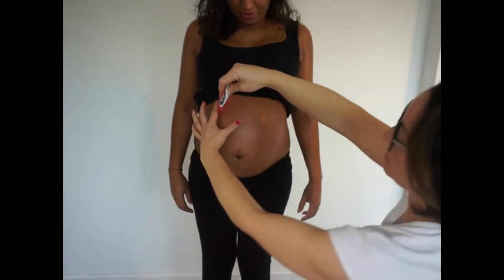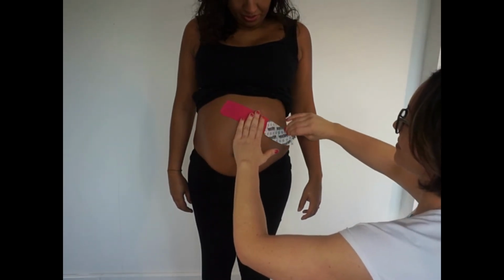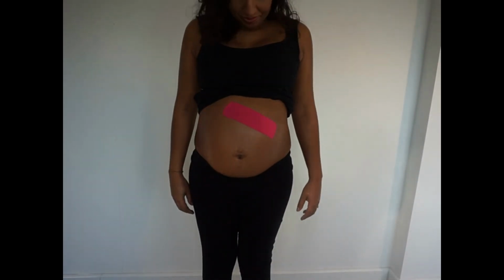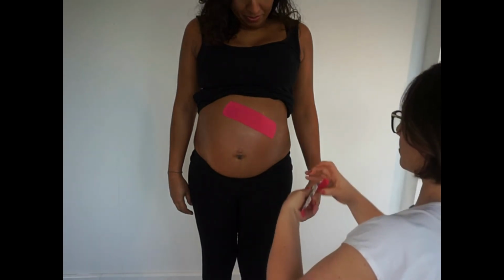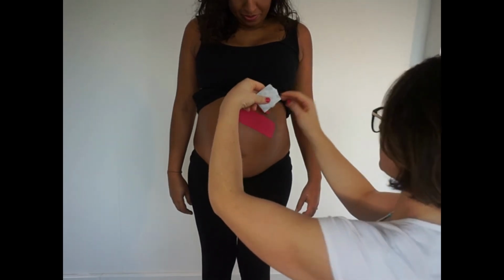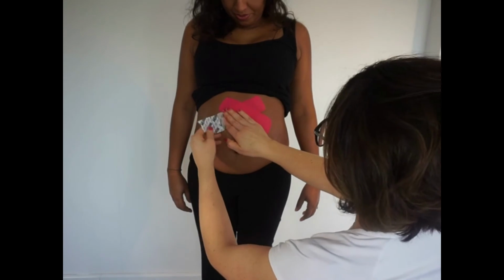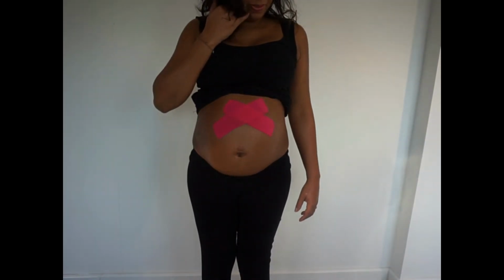So I'm going to anchor the tape to one side of rectus abdominis, ask the client to hug the baby, so to bring the line together, and then I'm going to add just a light to medium amount of stretch over that tape. It must be comfortable for the client. So again, watching, anchor to one side. Now ask the client to hug the baby, so they're going to engage those abdominals, closing the line. A light to medium amount of stretch over the line and anchoring with no tension.